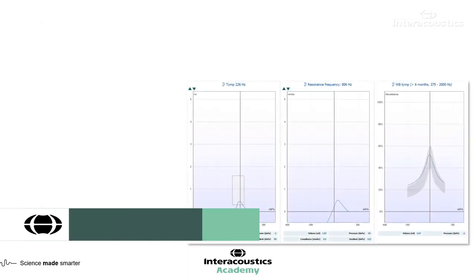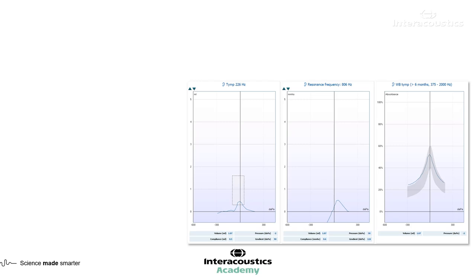Looking at the tympanograms page: on the left hand side you can see that noise on the 226 Hz tympanogram — it is a little bit wobbly and rough. But the wideband average tympanogram averages that out, giving quite a clean sweep on the right hand side, because multiple frequencies are being looked at simultaneously and that produces more of an average.